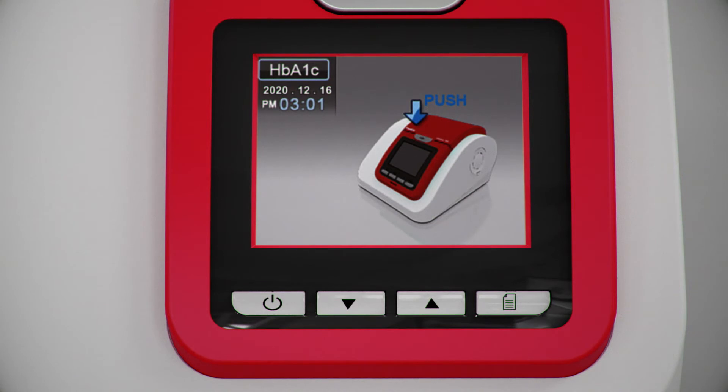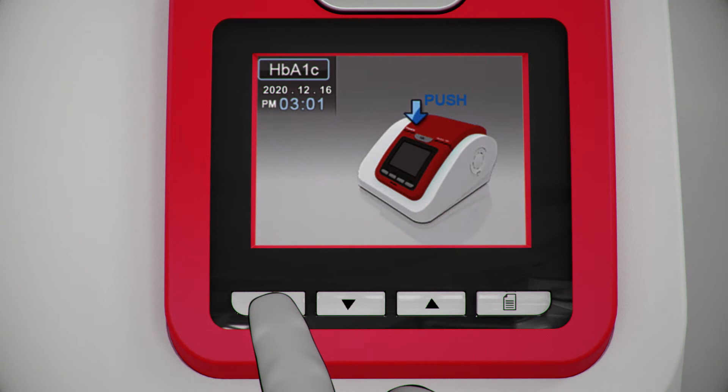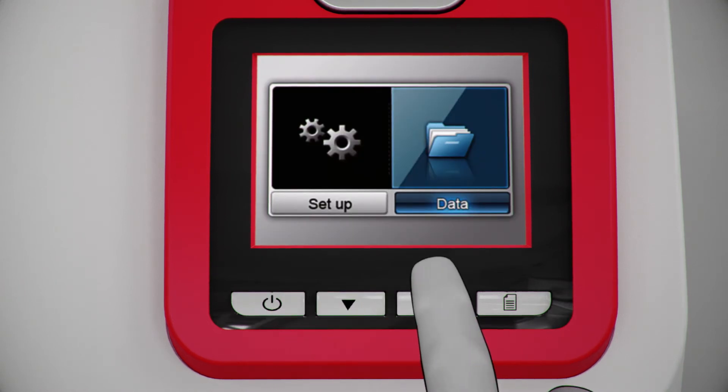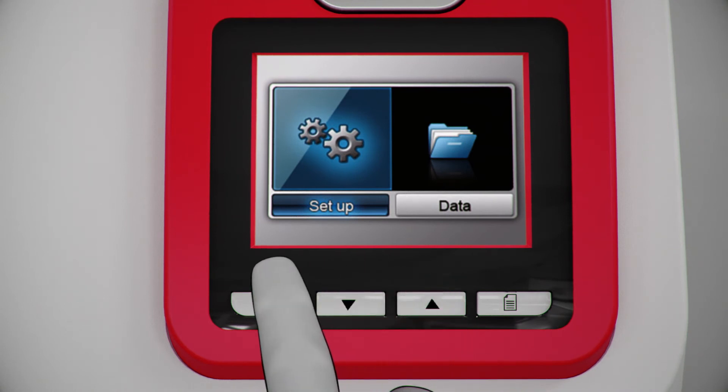In standby mode, press the mode button and hold for 3 seconds. Choose between setup and data mode by using the arrow keys, and choose setup by pressing the mode button.